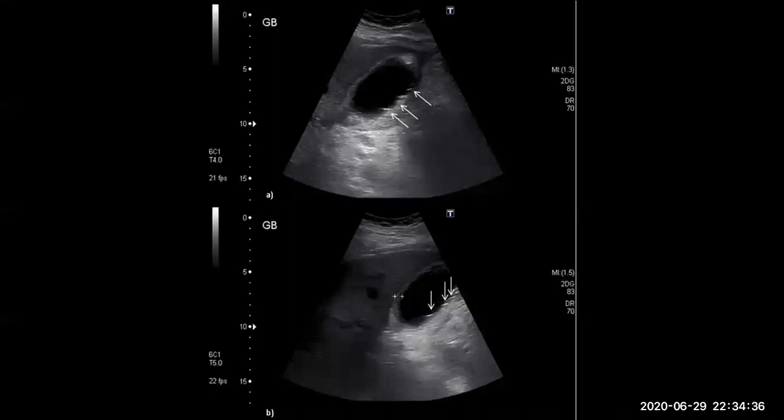This is an ultrasound in the gallbladder bed of the liver. See that the gallbladder is normal inside, not distended, and normal wall thickness, containing in the posterior wall multiple echogenic foci. Differential diagnosis, multiple small stones or polyps. This is not causing a posterior acoustic shadow, so I will go with the multiple polyps.